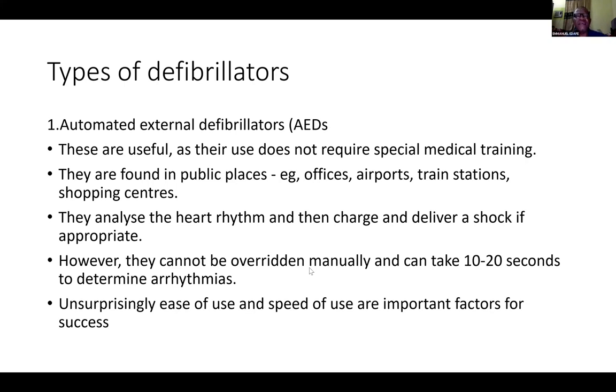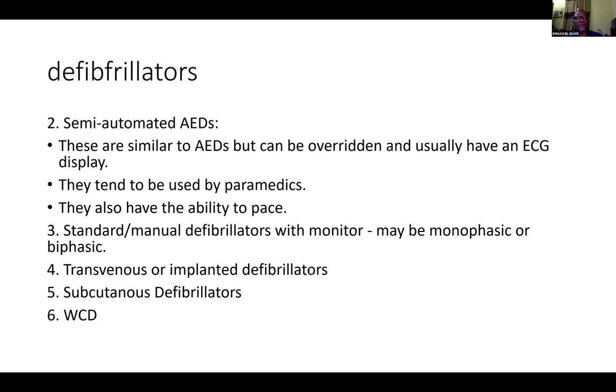If somebody has had a sudden cardiac arrest, you can just place the pad and it directs you on what to do. The ones that are fully automated do the work themselves, while the semi-automated ones need some assistance from a bystander to press the button and give the shock. But it also directs you, it reads, and it talks back to you.